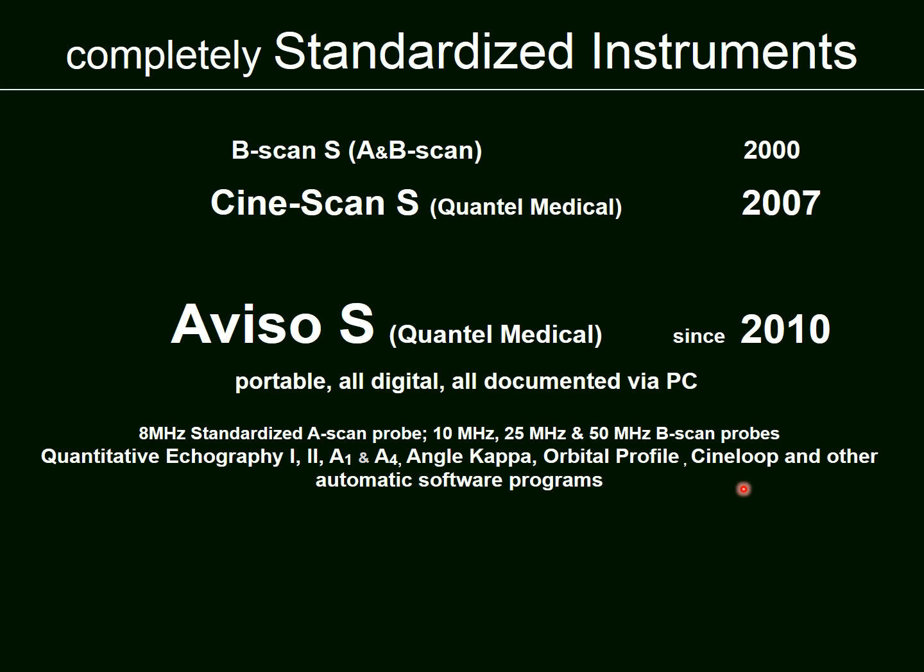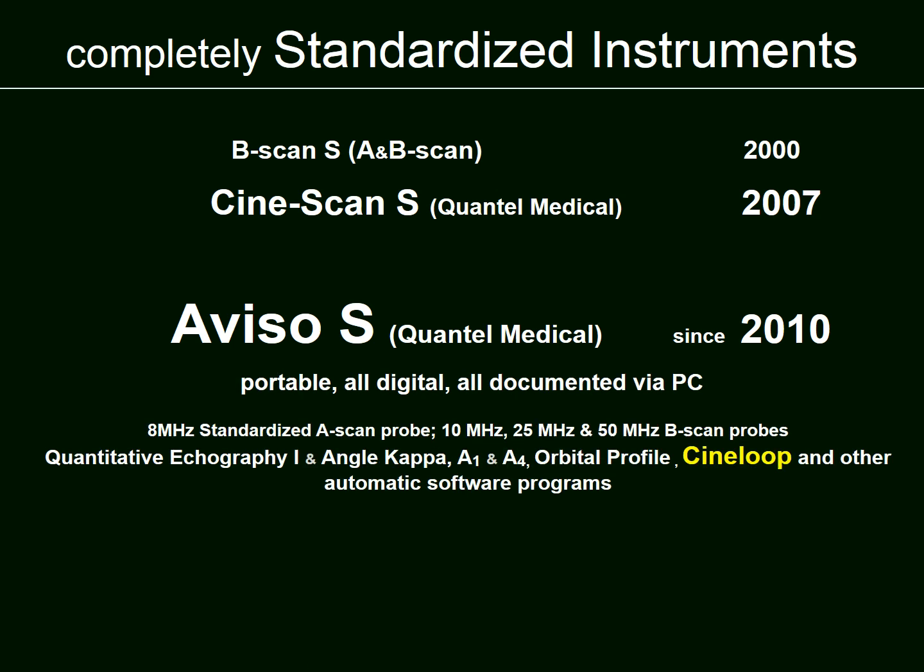The Cine loop changed particularly the A-scan technique and made it much simpler, easier and faster.